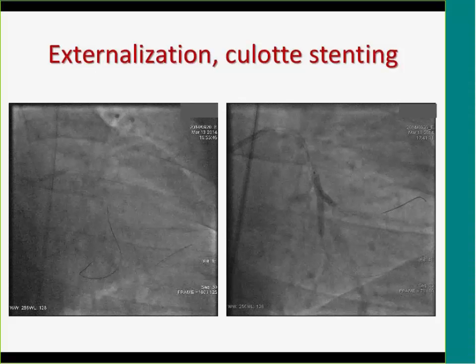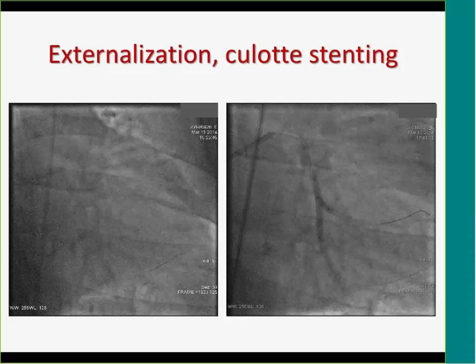And when we were in the guiding catheter, we could change the Confianza to an RG3.